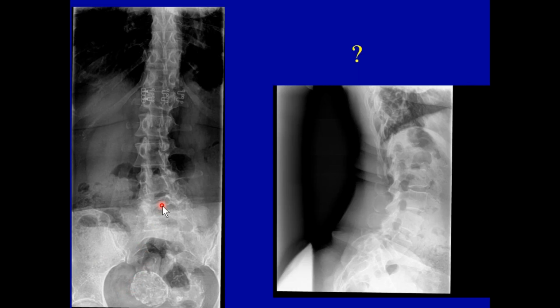This was well done in terms of an AP digital examination. The lateral is well done technically. All right, nice collimation. But even on this one, if you are able to do something with the bra straps, that would be ideal.